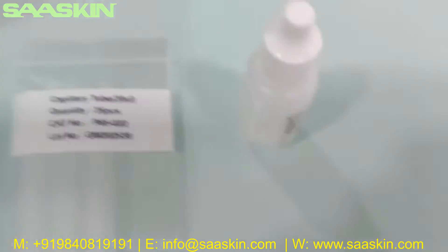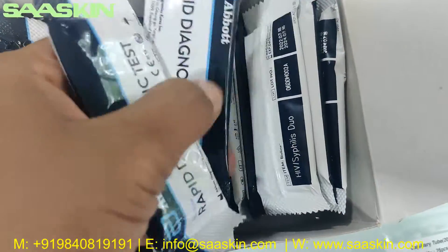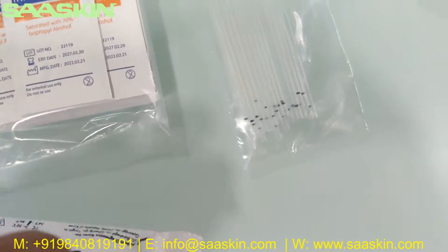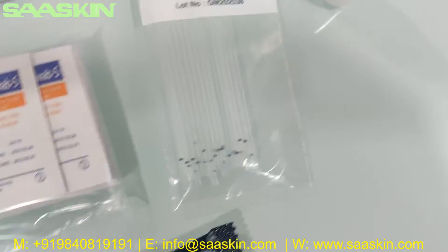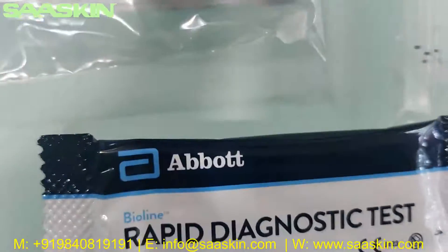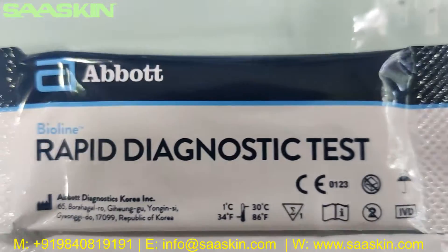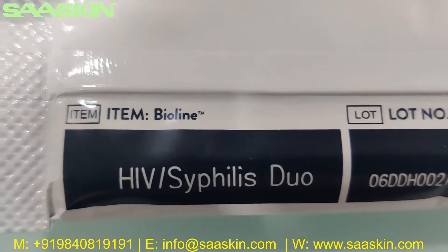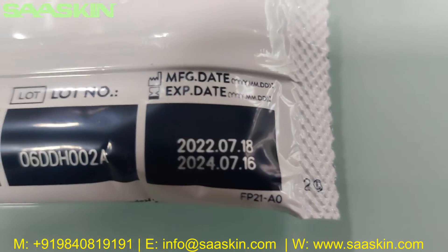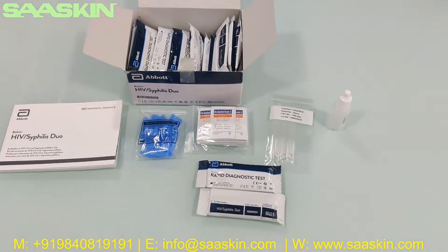Inside you also have 25 test cassettes. Taking two out, you can see the front side says Abbott Bioline Rapid Diagnostic Test Kit with an individual foil pouch. On the back side it says HIV Syphilis Duo, with the lot number, manufacturing date, and expiry period — standard 2 years of expiry.